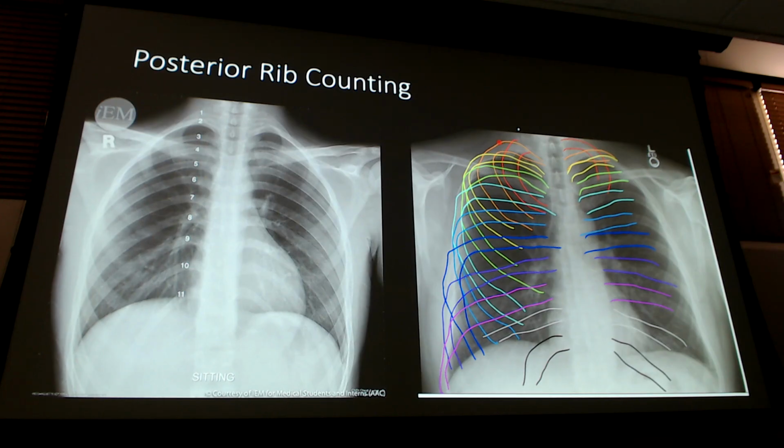My anterior ribs, when they hit, curve around, right? They're curving and coming up into the sternum, right? It's not this nice kind of horizontal, slightly downward shape. They're curving around and coming up towards the sternum. So when we get to the anterior, that's why they have this sharp downward projection, because of the way they curve around and come into the sternum. Whereas they're nice and flat and horizontal back here. That's why these are our posterior ribs.